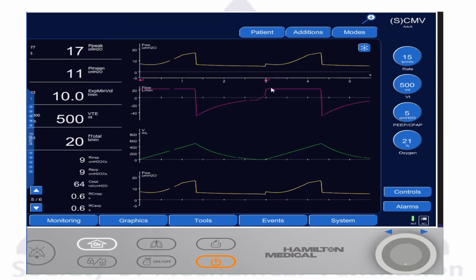You can see again he's triggering the vent. There is a drop of the flow here that triggers the ventilator, and the more we increase the patient effort, here he's now breathing, the PMUS is 15, and look how deep the breath goes, even to 0. So if you really measure the transpulmonary pressure, despite the peak airway pressure or the plateau pressure being low, this patient will have lung injury. So that's one of the reasons I really do not like to use this mode. I don't have an esophageal balloon in this monitor to show you or to calculate it for you, but we talked about it in one of the other videos before.